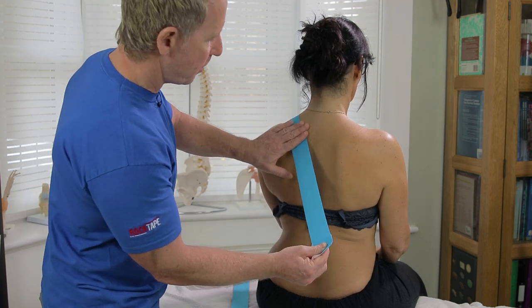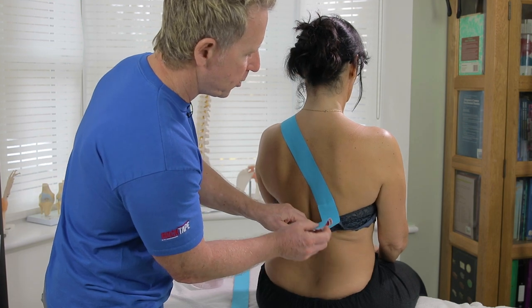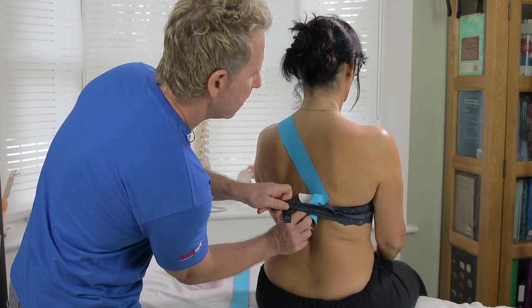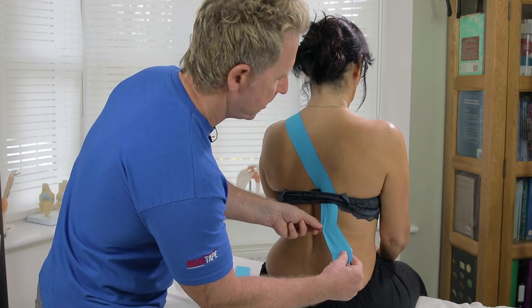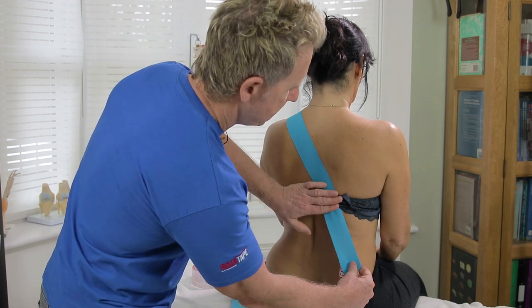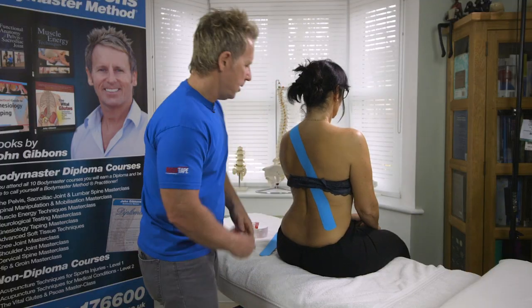You can see in this case the lady has a bra strap on so it's slightly awkward, so we're just going to come under that. I'm going to ease off the tape here and come under — okay, I've done okay here. I'll just peel out that little crease and then continue at 50% down to that right hand corner of the lumbar spine. That's the first part.